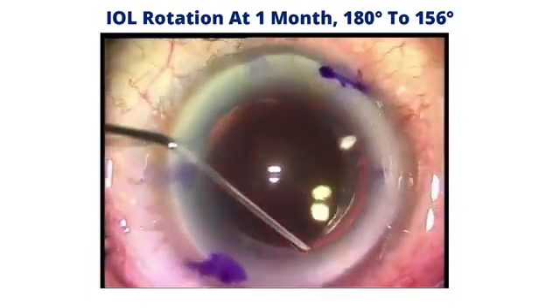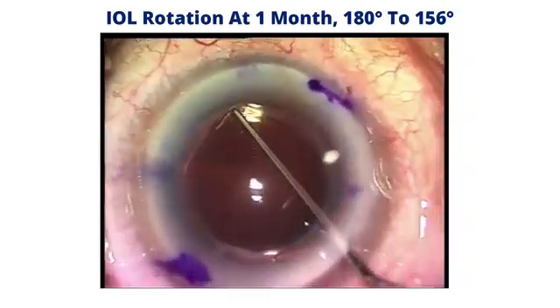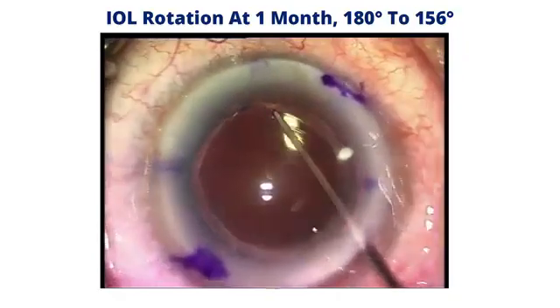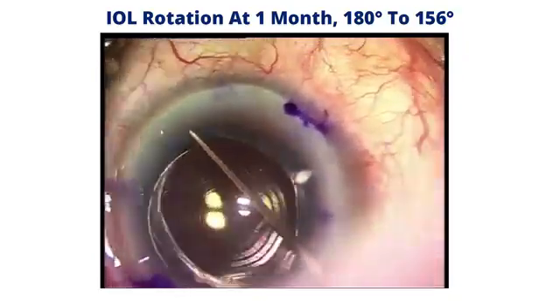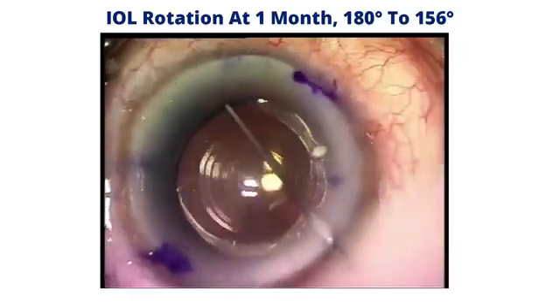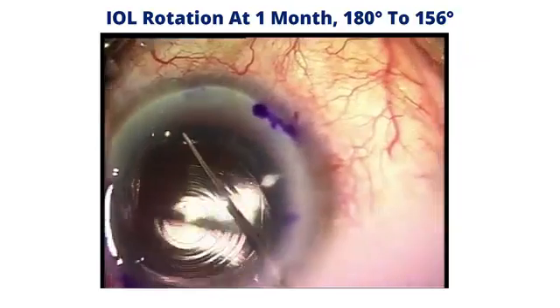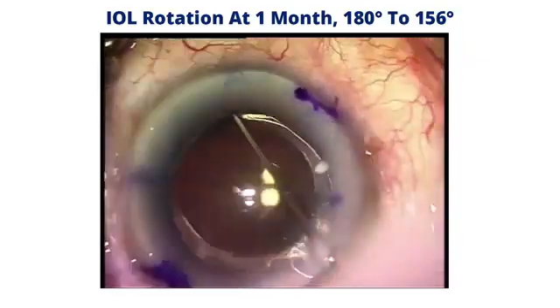So again, inject viscoelastic first into the anterior chamber, pick up the space between the anterior capsule, which is slightly fibrosed here, and I'm struggling a little, and the IOL. And you can see going near the haptic sometimes does help, because you can push against the haptic and not fear plunging through the posterior capsule.